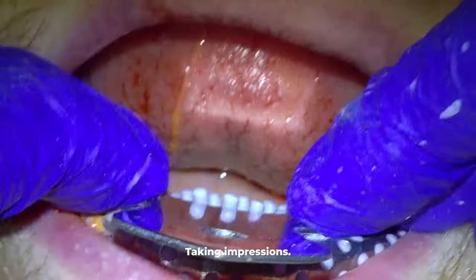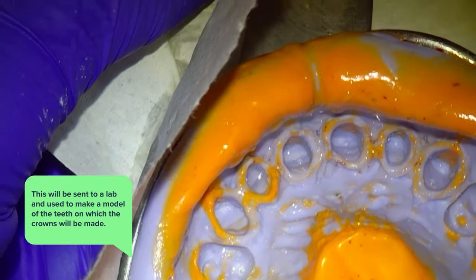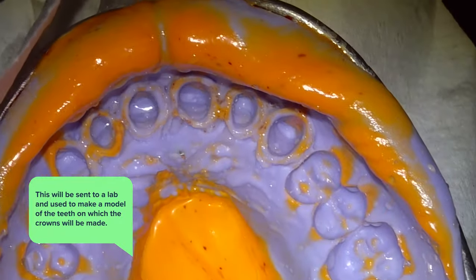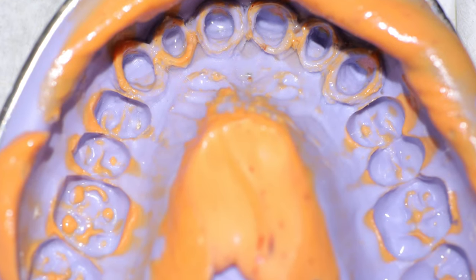Once the impression material is all set, this is what it will look like when you take it out of the mouth. This will be sent to the lab and used to make a model of the teeth on which the cosmetic crowns will be made. And so they can make accurate crowns, we have to get a shade that we want for these teeth.